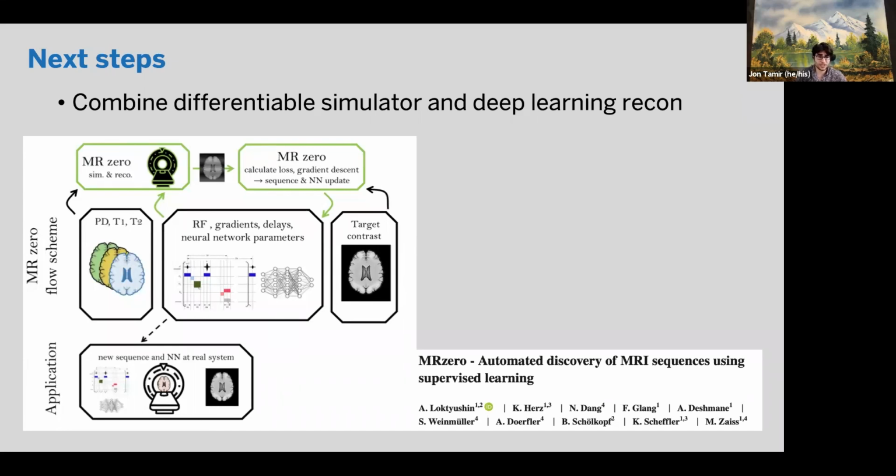But I would really recommend checking out this paper that talks a little bit about some of these challenges. In particular, the training time for these is very expensive because one outer loop of this training algorithm can take 30 minutes.